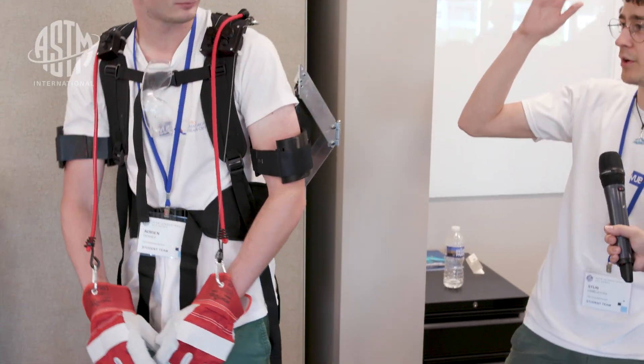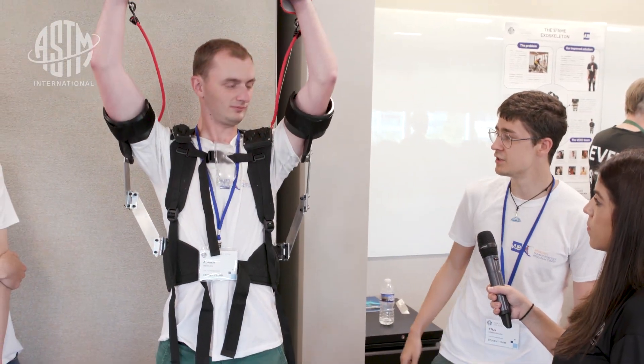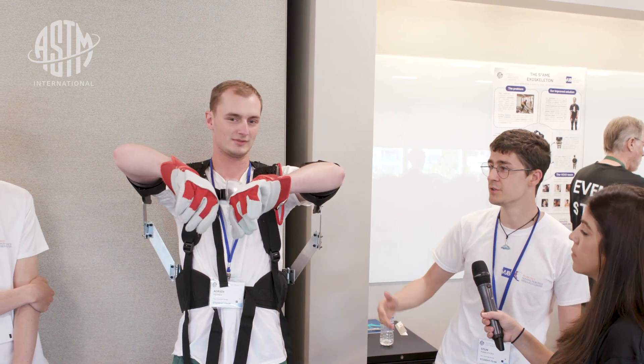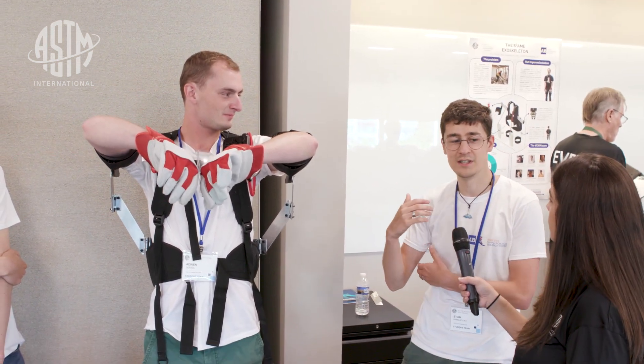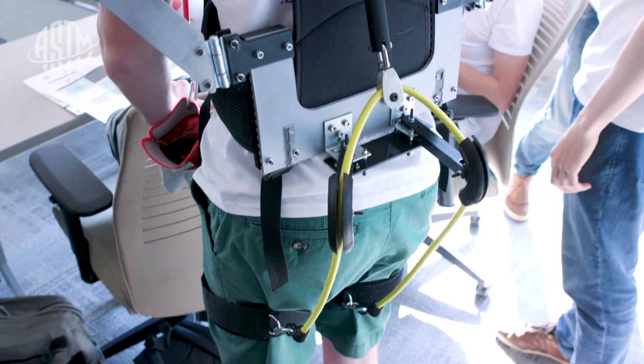If you want to do some task overhead, we basically make it so you can rest. As he demonstrates, you can rest your hands at a certain position, so you don't get fatigued from just holding it in an unnatural position. Through the competition, we learned about exoskeletons, and I also started a PhD in exoskeletons through the competition. So it really brought the technology to my knowledge.